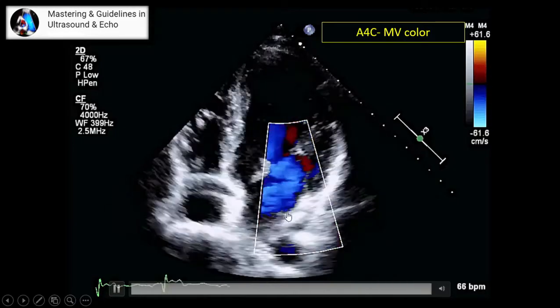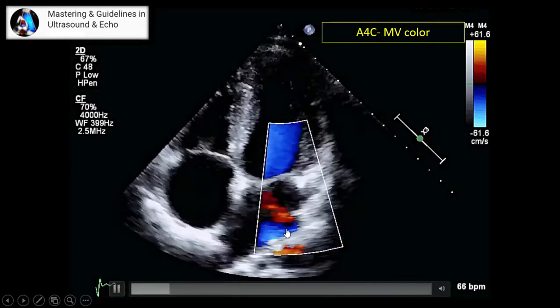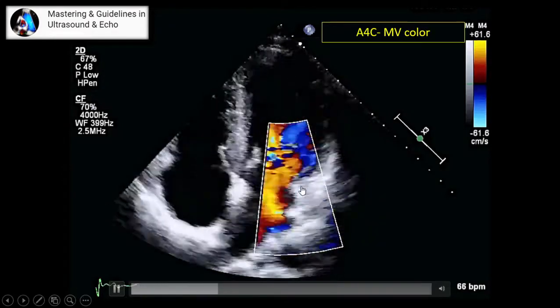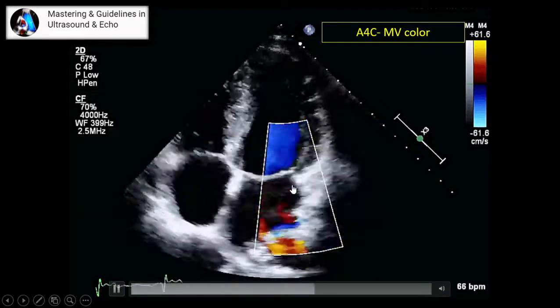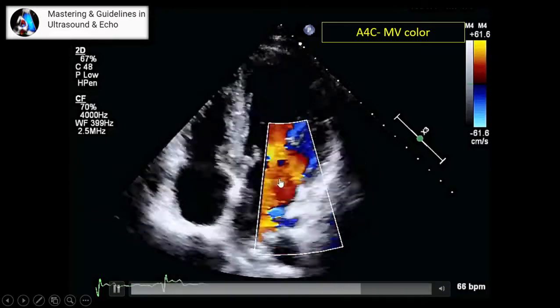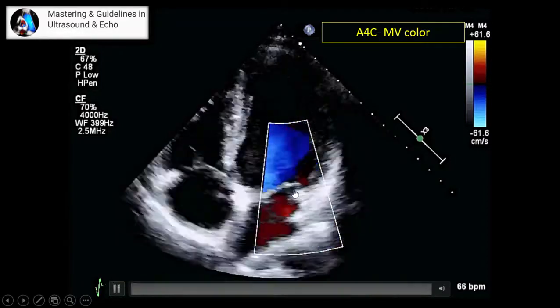If you need to check other fluid around that structure, that's fine. And as I mentioned many times, the principle for detecting any abnormal jet is surveying or sweeping that area.